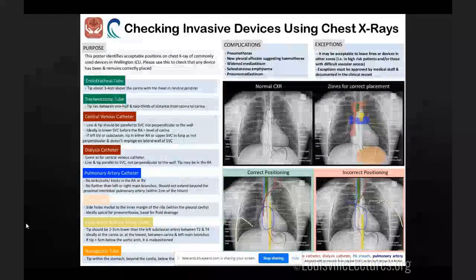And so you'll see what's called a radiopaque stripe. There's a strip of metal that goes down the entire length of the ET tube, and that stripe helps identify that this is the ET tube itself, in addition to the outline of the ET tube when caught on focus.